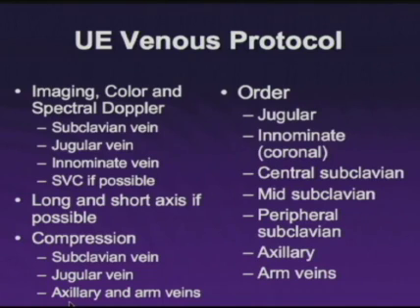Again, we recognize that because of beam width artifacts in the presence of the nearby pleura or lung or mediastinal fat, there may be echoes inside of these structures.